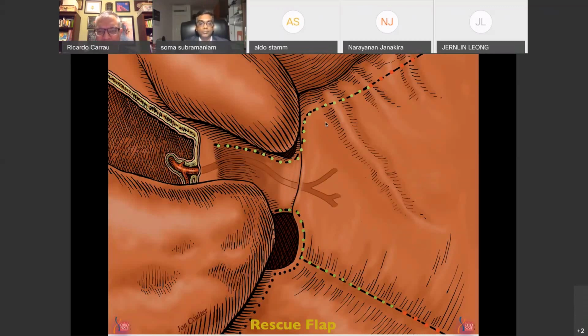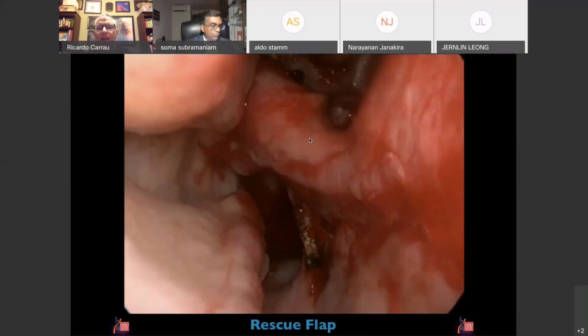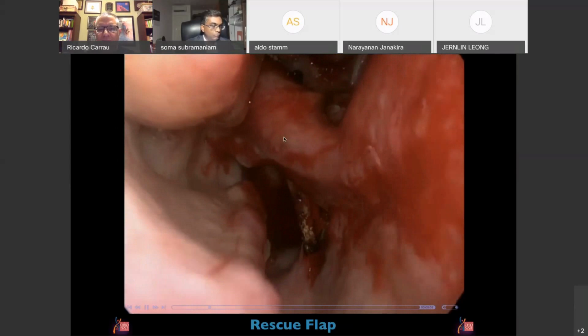So we make the incisions. You can make the superior, you can make the inferior incision if necessary. Usually just the superior is enough. Remember to do it below the olfactory epithelium so you don't cause olfactory function deficits. And then by doing that, you don't have to raise the flap. So if you do the two incisions, it looks like something like this.